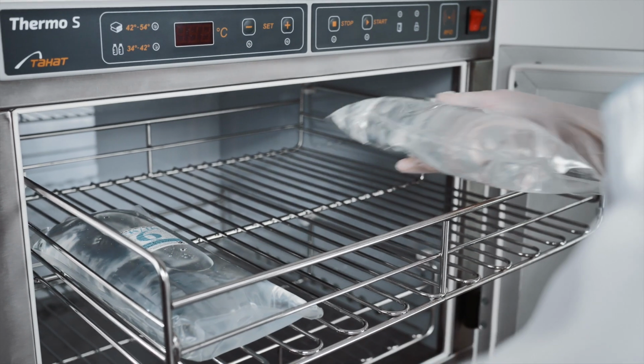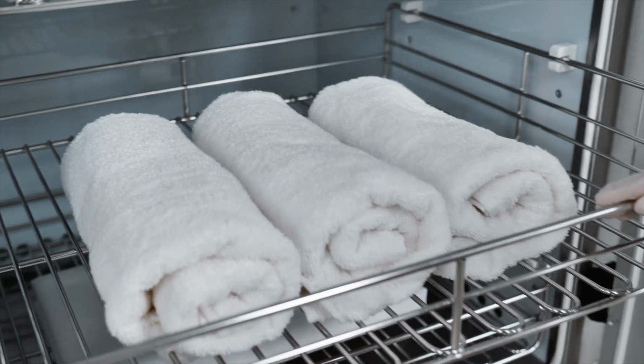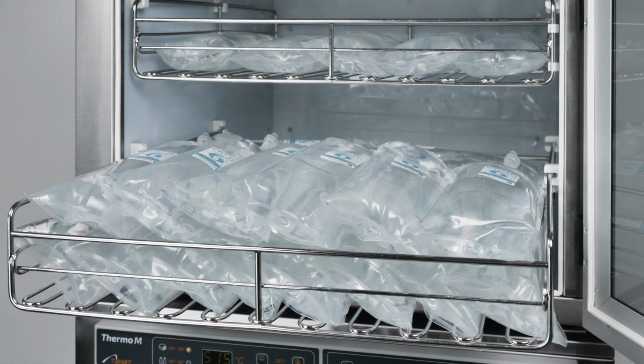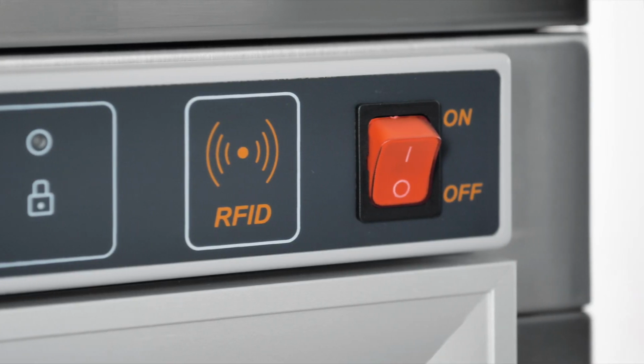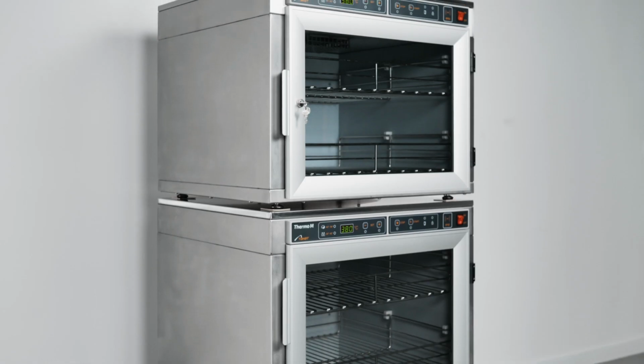Place fluids, infusion solutions, or blankets. Keep in mind that fluids and blankets must be stored in separate compartments. Maximum load per shelf is 20 kilograms. Turn on the warming cabinet. Previously set temperature will appear on the display.